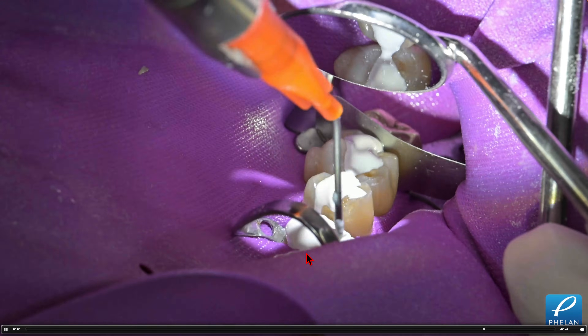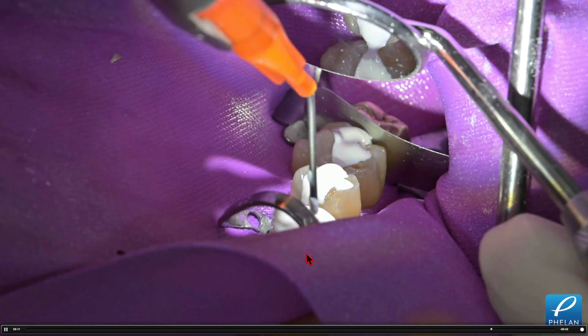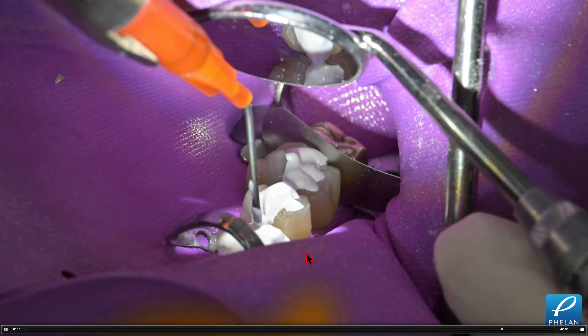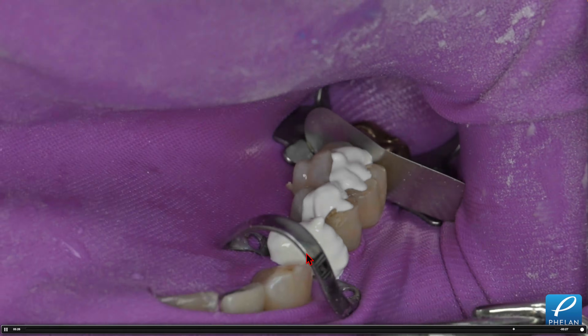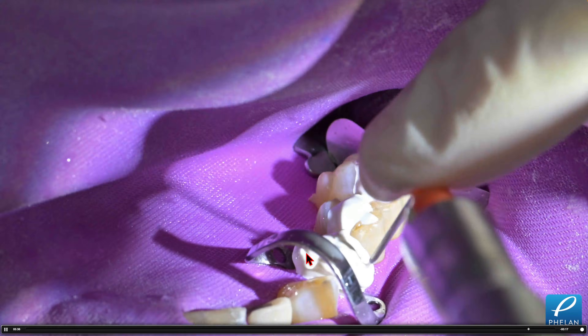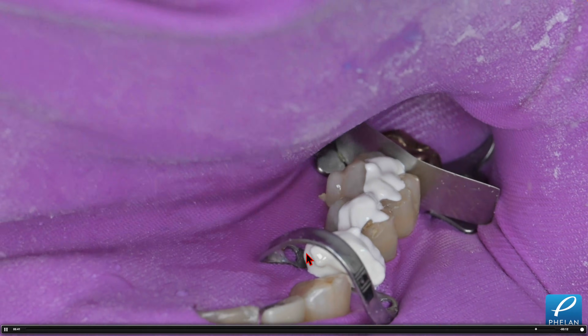That tooth was prepped, but it was a pretty small prep, so I just wanted to add more volume to the tooth preparation. I'm doing a core paste buildup on top of the prep, and then I'll basically prep it again but leave more tooth structure there, which is partly core paste. That shows you a good idea of cutting off these crowns and some tips with the rubber dam, the B4 clamp, and stacking these cores with this Denmat self-cured core paste.